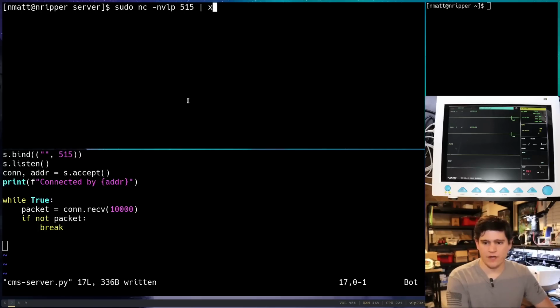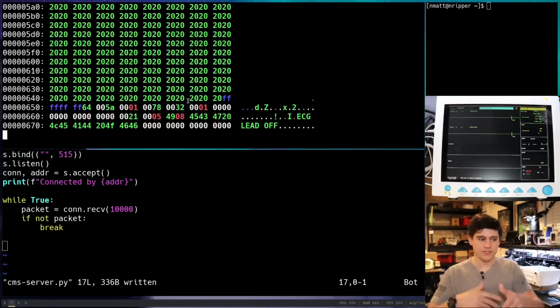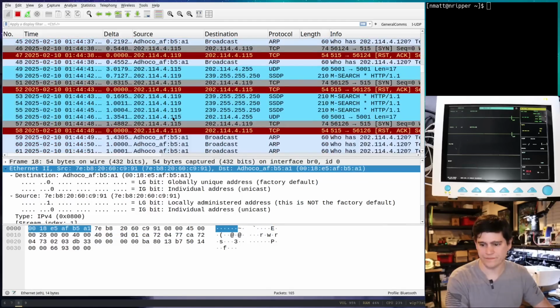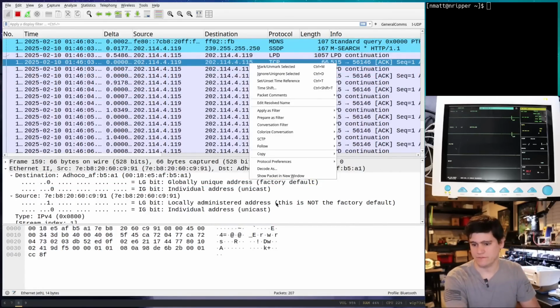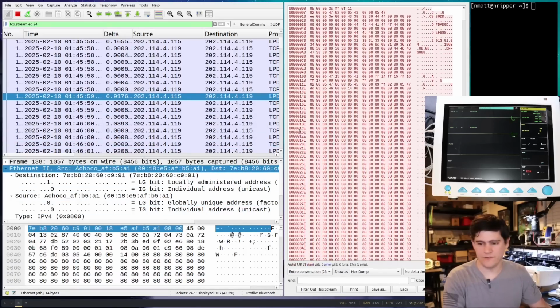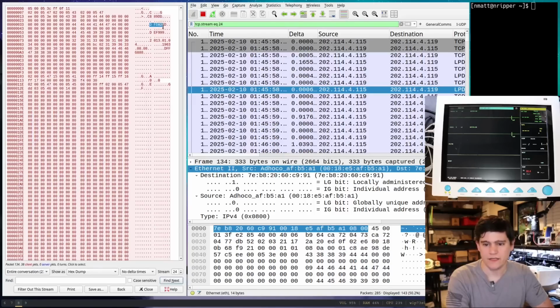I'm just going to feed this into a hex editor, and that should start getting data flowing in. Then we're going to see a very similar set of data show up down here in our PCAP. What I'm going to do with this TCP stream is find one of those TCP packets, right click on it, and click follow TCP stream. Here we get a very similar kind of view to what we saw in the article, right? We see similar pieces of data, and if you're wondering what these are, it's kind of hard, I can't make this bigger.